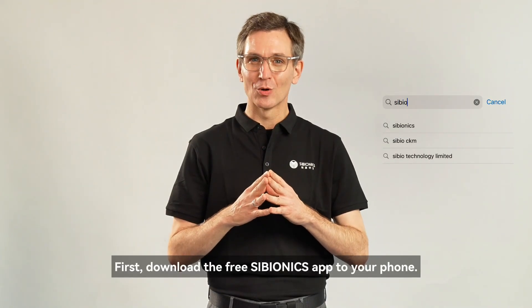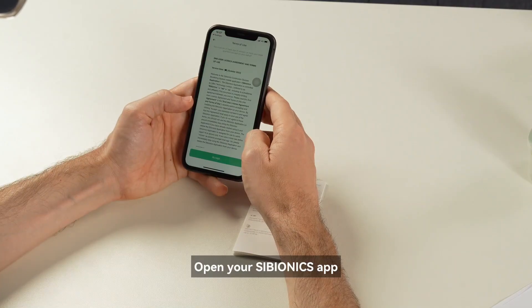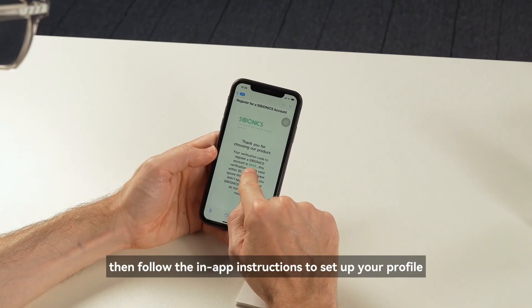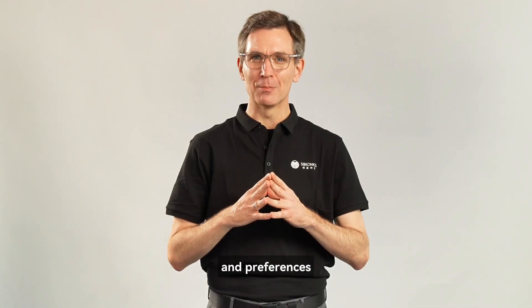First, download the free SIBIONICS app to your phone. Open the SIBIONICS app. Register an account with your email address. Then follow the in-app instructions to set up your profile and preferences.